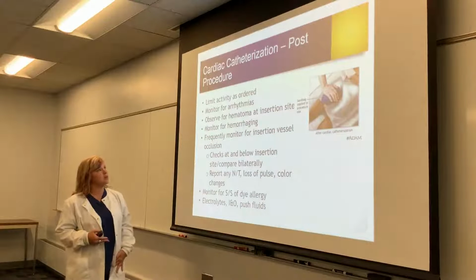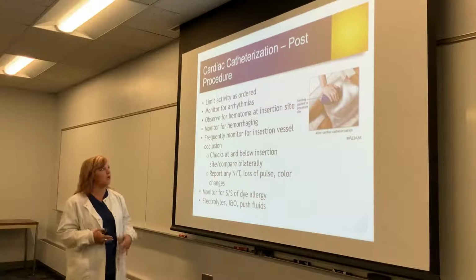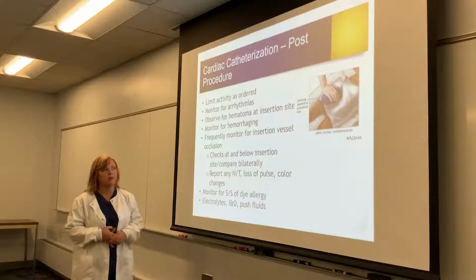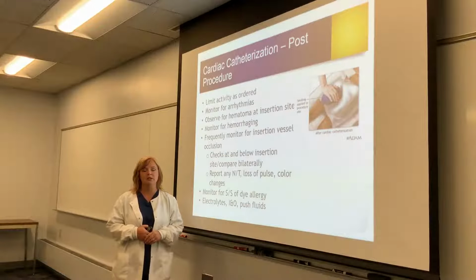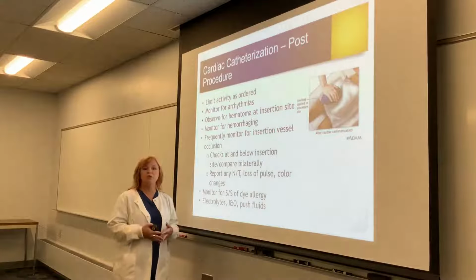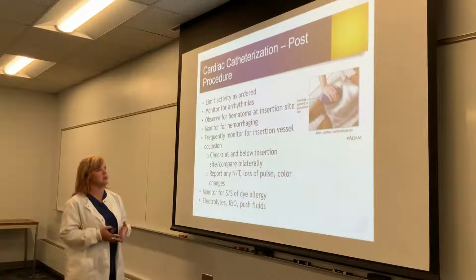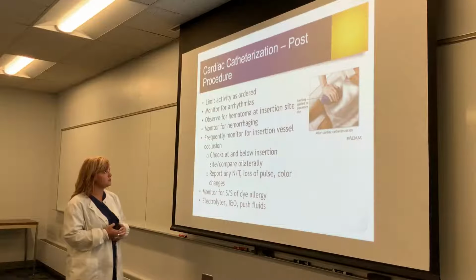You'll be watching the site for any problems with the site, pain, hematoma, anything like that. And typically you're following post-procedural vital signs, so Q15 times 4, Q half hour times 2. So you'll follow whatever the provider orders or whatever is site specific, but that's kind of the general.